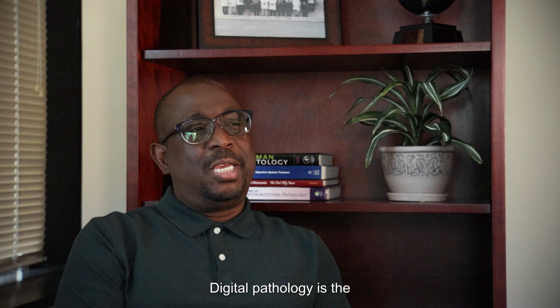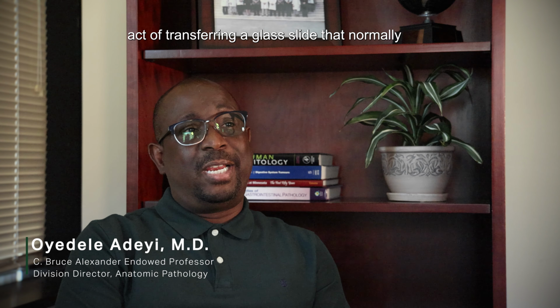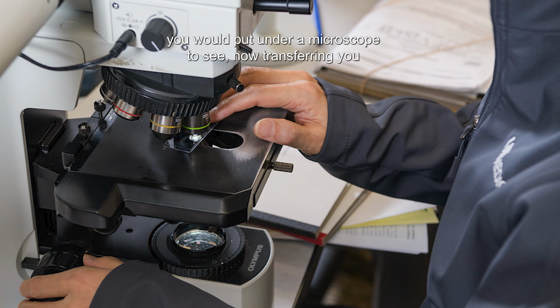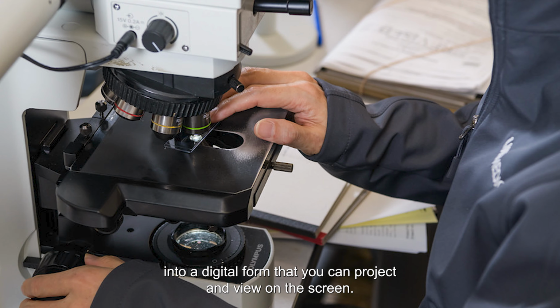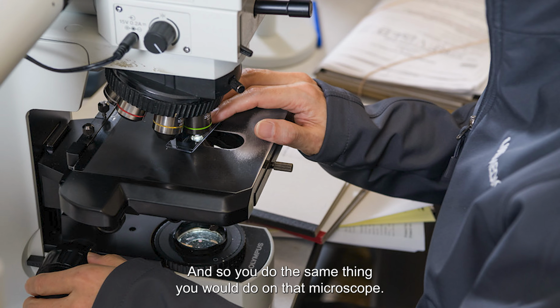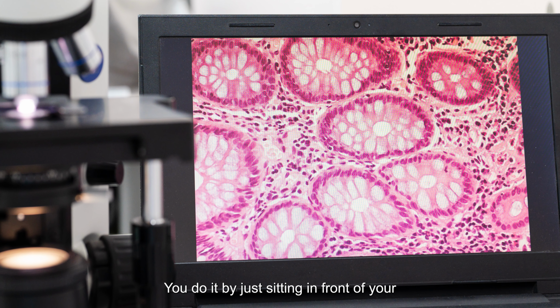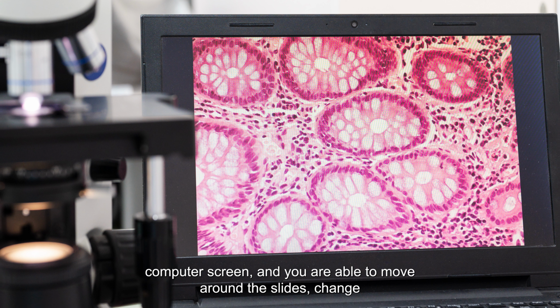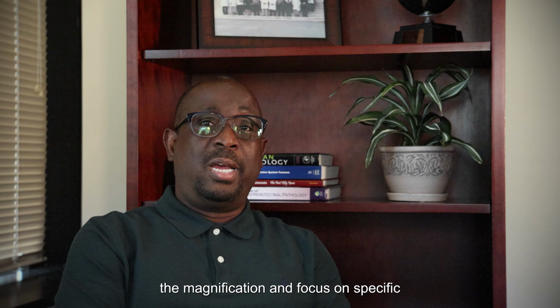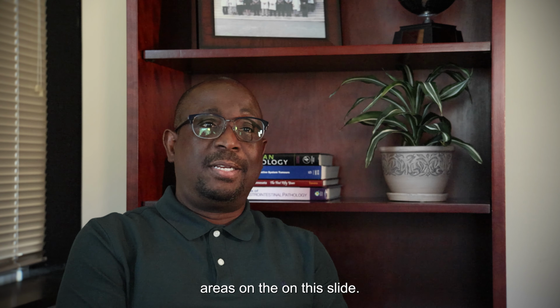Digital pathology is the act of transferring a glass slide that normally you would put under a microscope to see, into a digital form that you can project and view on the screen. And so you do the same thing you would do under the microscope. You do it by just sitting in front of your computer screen, and you are able to move around the slides, change the magnification, and focus on specific areas on the slide.